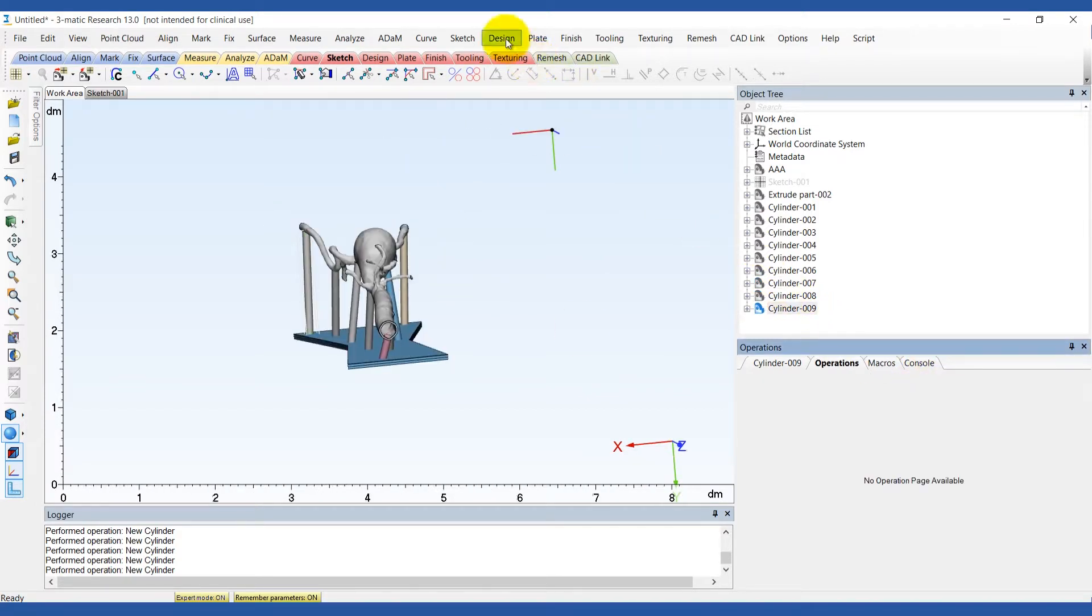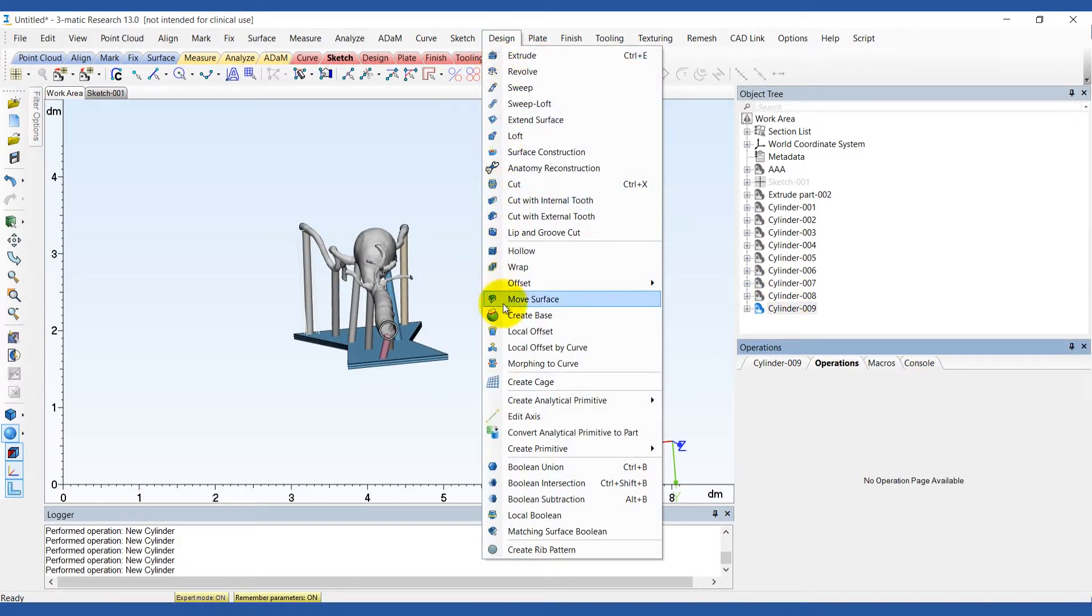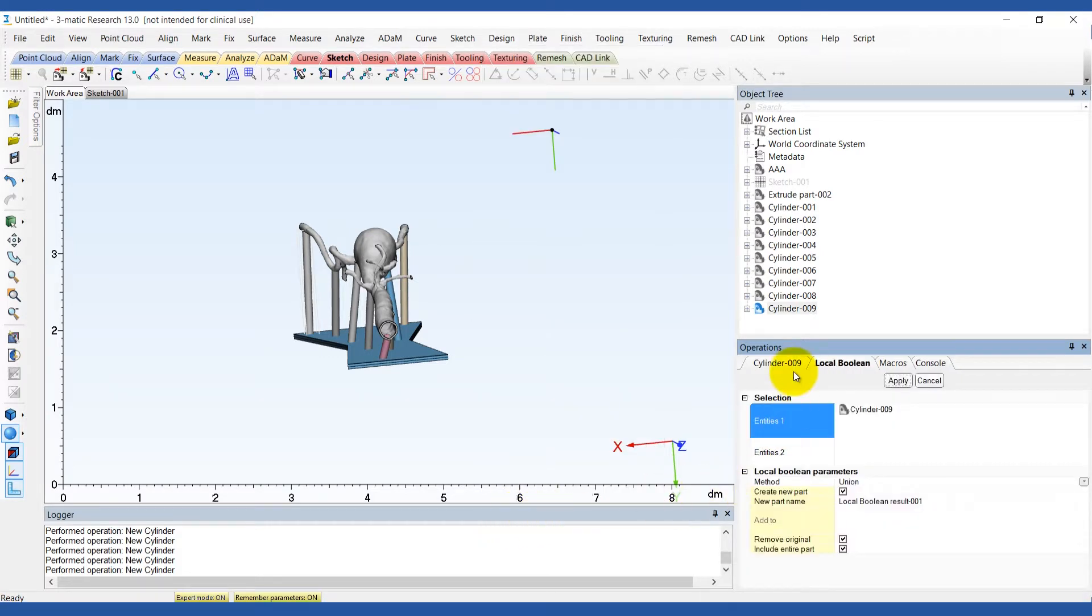After creating the cylinders, perform a local boolean operation to join the extruded supports to the top surface of the base.